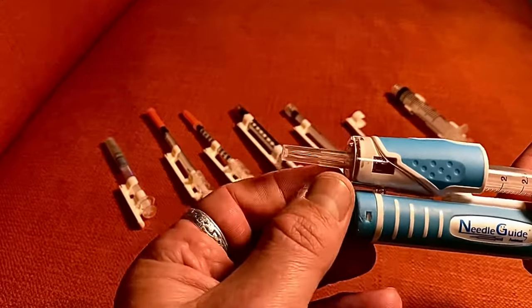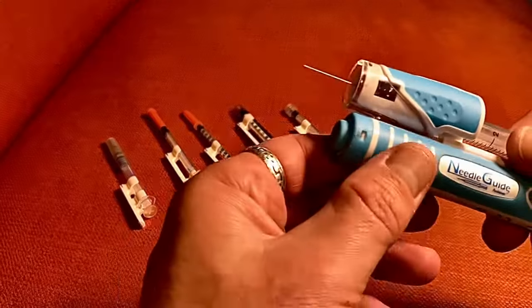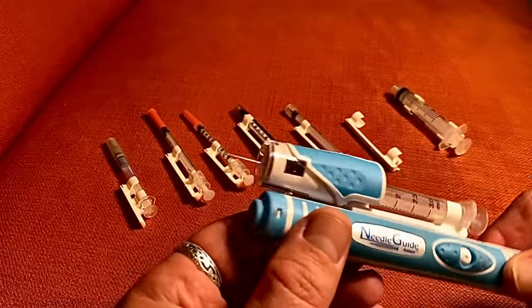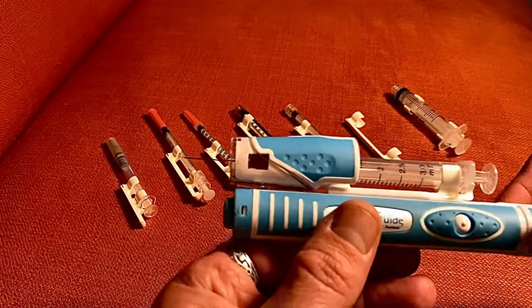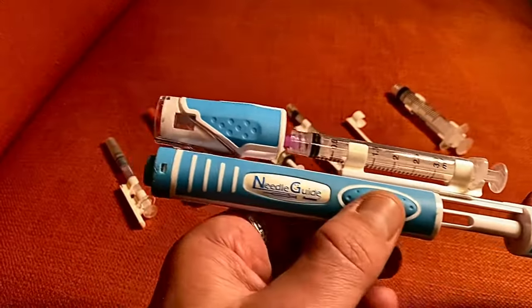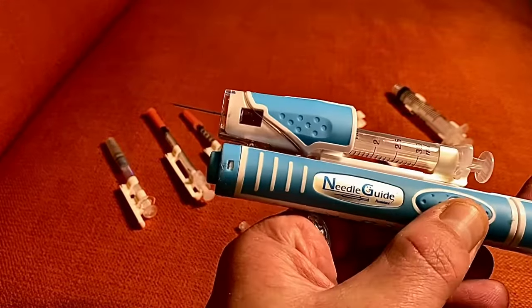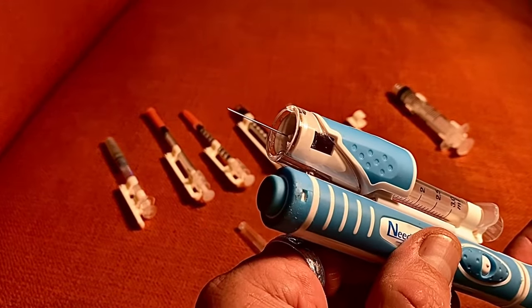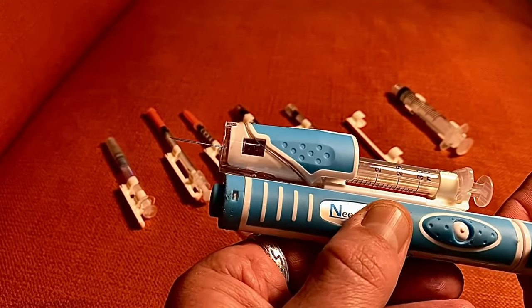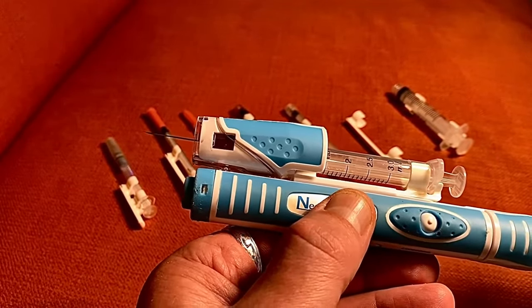A commonly asked question is why the syringe does not go all the way to the very end. That's because of the universal application — it can't be perfect for every single application. But as long as you're able to get into the muscle for your injection, it's not going to be an issue, so don't worry about that.